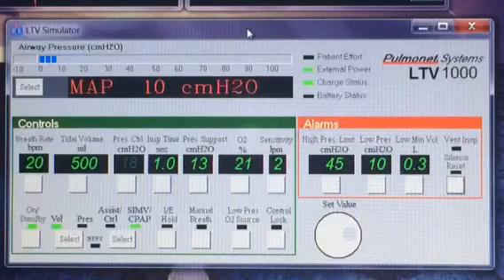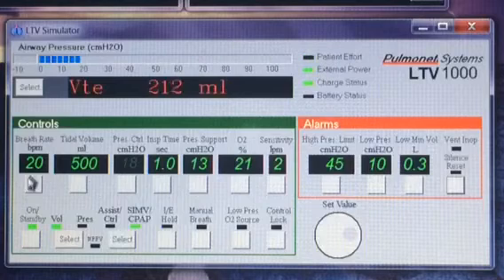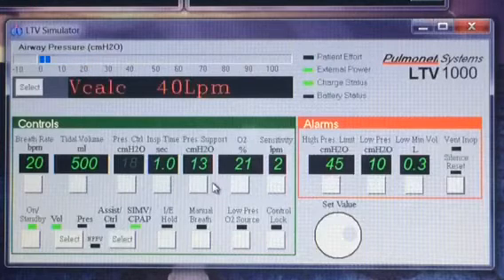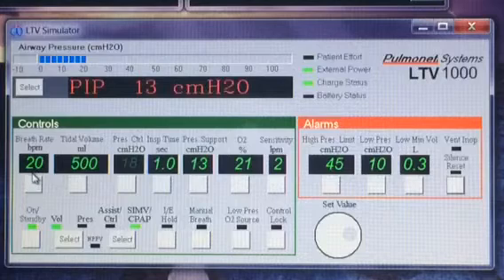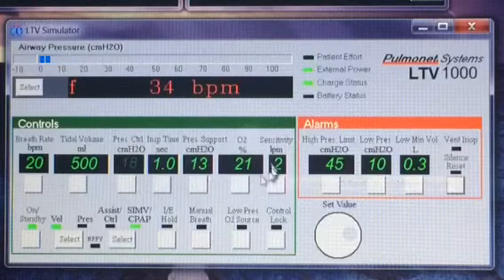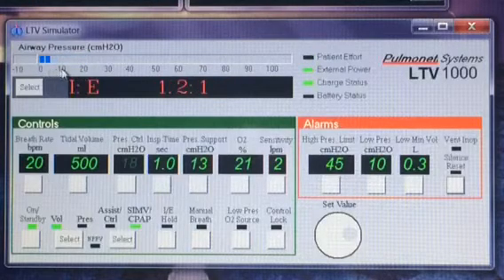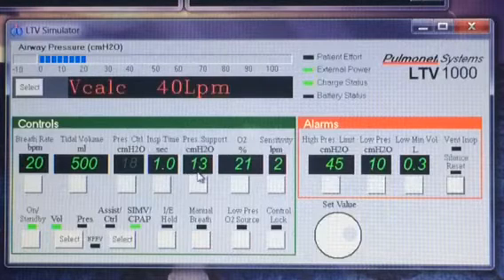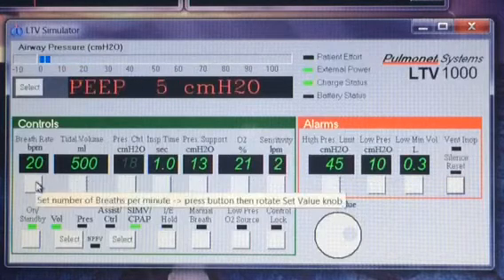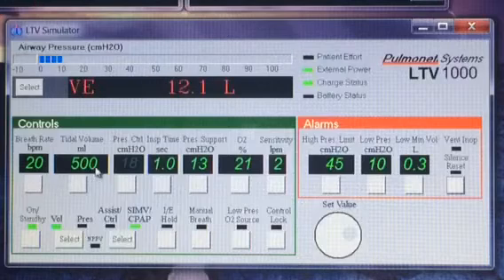A reason why SIMV is so good for weaning patients off the ventilator is that it gives, in this instance, 20 breaths per minute — 20 big deep breaths — but it lets them trigger extra breaths in between without letting them wear themselves out. They'll start at a higher breath rate when they begin weaning. Anything in between the mandatory breaths, they can take on their own. And as you can see here, when they take an extra breath, it'll say "patient effort" and the pressure will only go up to 13, because that's the pressure support helping them overcome the tubing. But if they take one of these extra breaths within a fraction of a second of when a mandatory breath is supposed to be given, it will synchronize with them — that's why the S is in the name, synchronous. It'll synchronize and give them the big deep breath at that time.